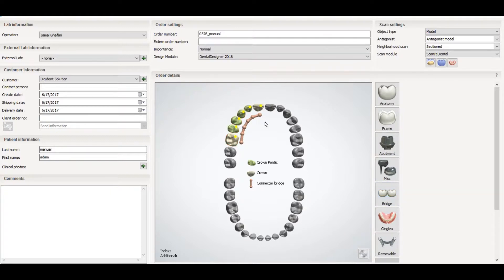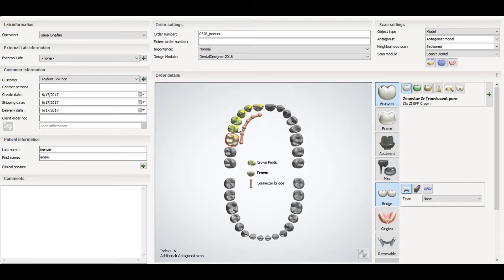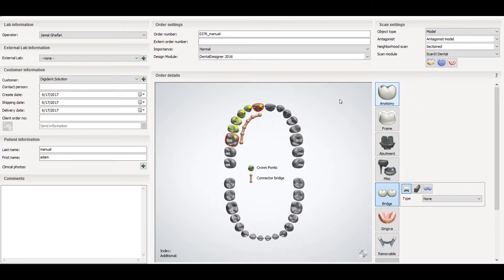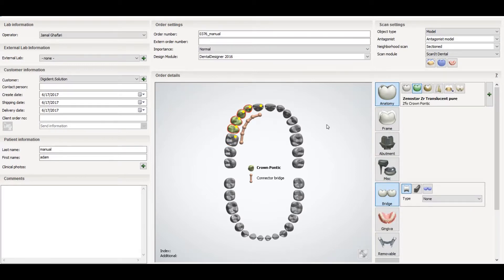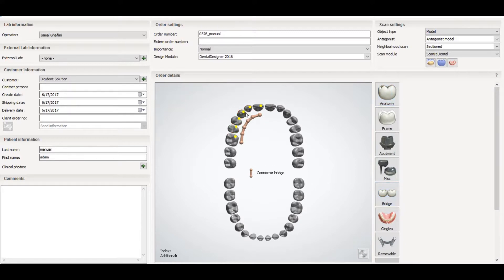If you want to deselect, just select nothing — go to the option and make it the same for the bridge.